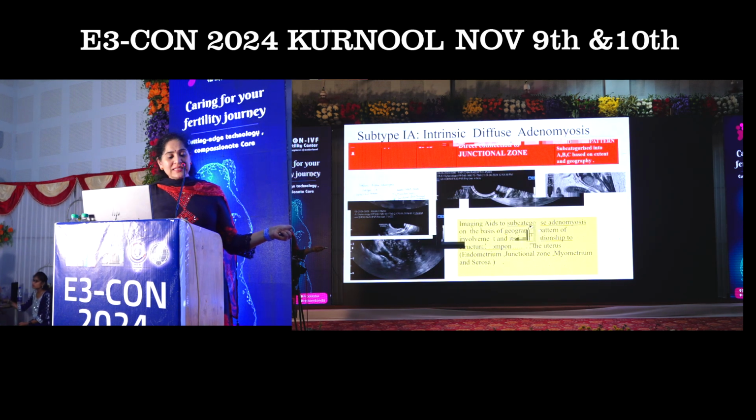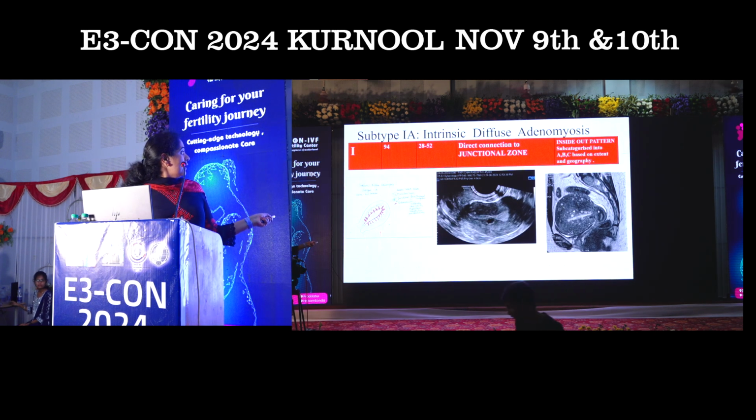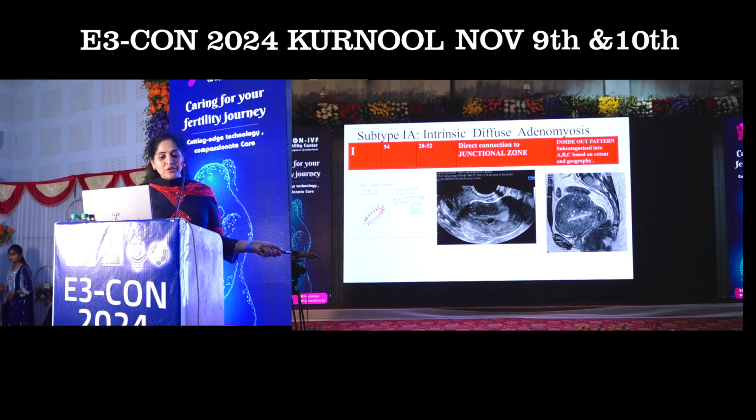diffuse adenomyosis, here the pathology is epicentered into the junctional zone inside out and it will be central in nature. It is the most common type of adenomyosis which you see.